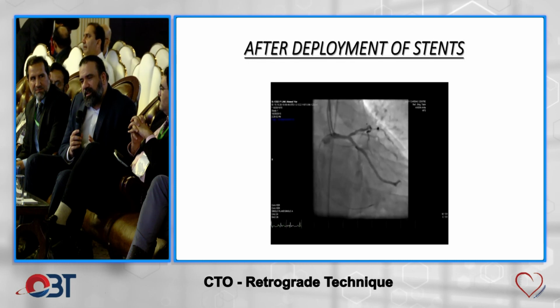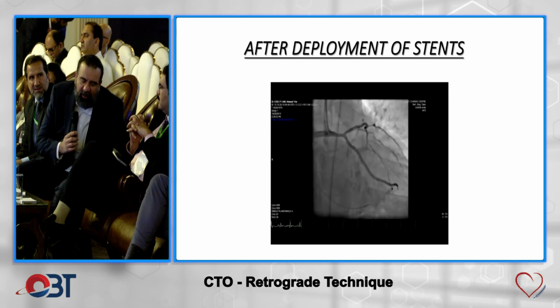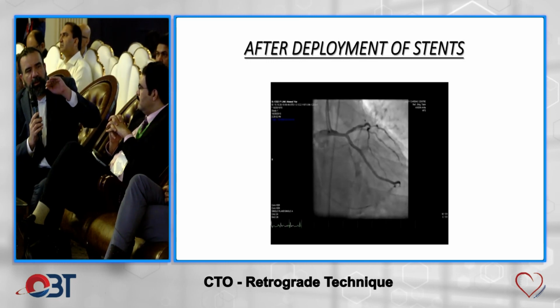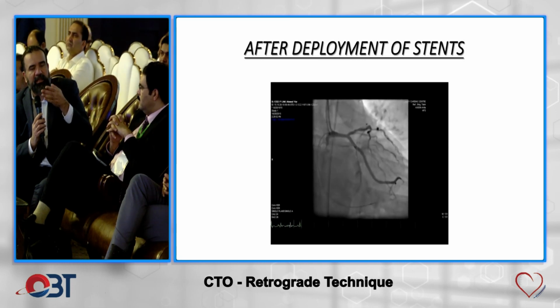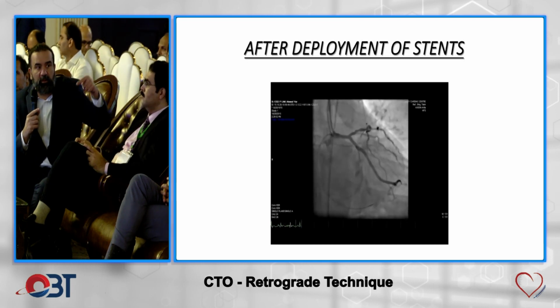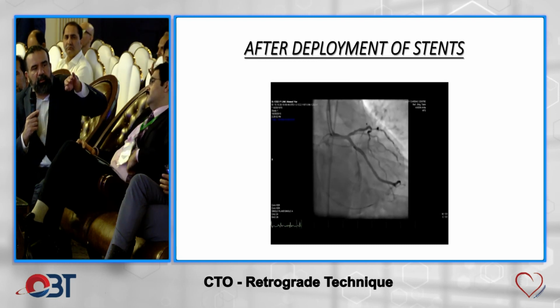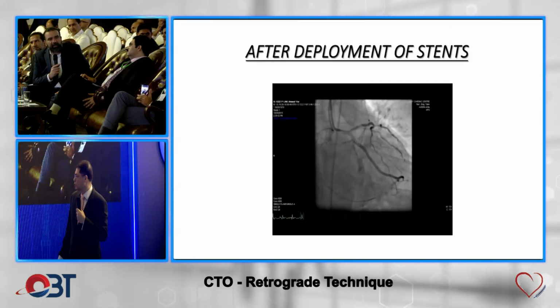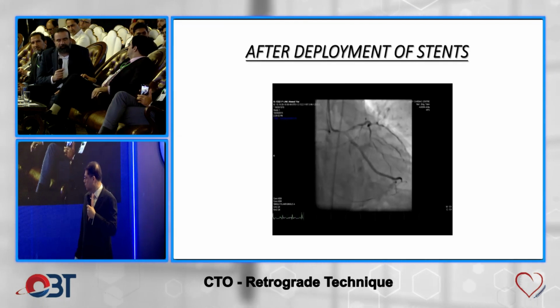The short answer is yes, but it requires experience. In tip-in, you need to have some curved angle where you tip in, because with a curved angle, on two different planes, in two different dimensions, that's the point where the wire has to cross and the catheter has to cross from the other side. You can find that curved spot either in the curve of the EBU or usually on the top part of the arch. So you can also use that. That requires experience and it saves you a snare, but tip-in can be done.